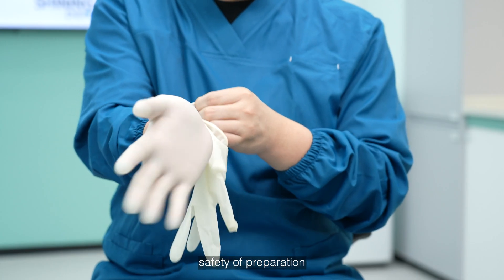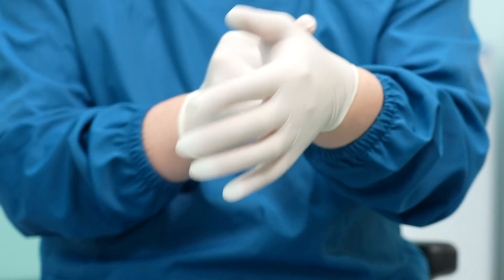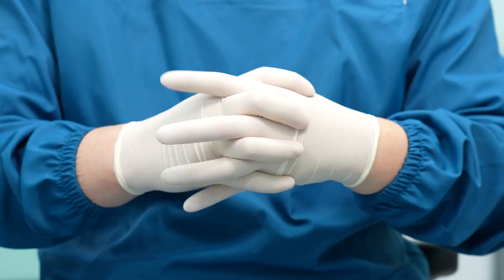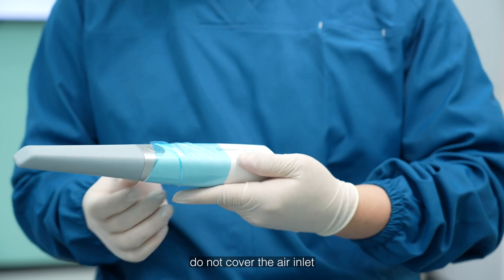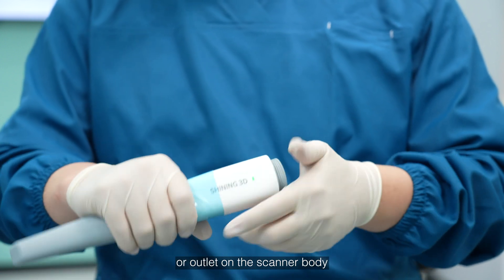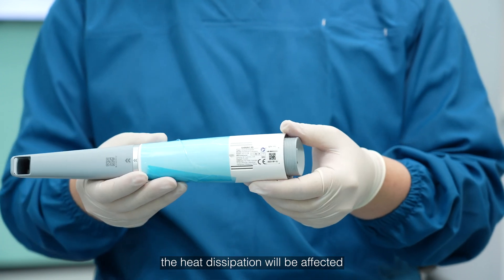First, safety preparation. For your safety, please wear medical gloves during the scanning process. If you want to wrap the scan body with an isolation or plastic film, such as blue film, do not cover the air inlet or outlet on the scanner body. Otherwise, the heat dissipation will be affected.